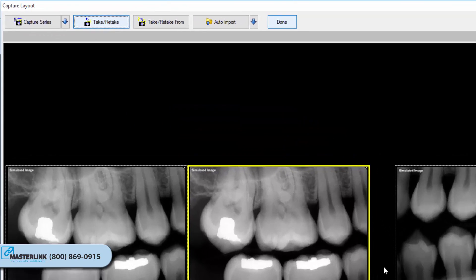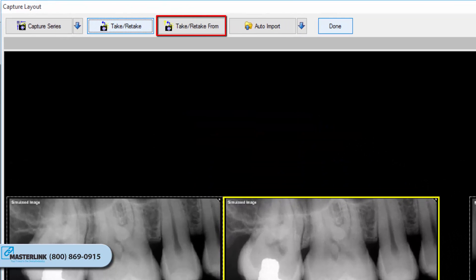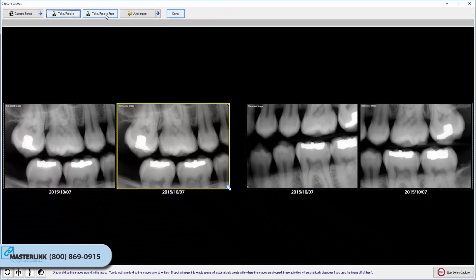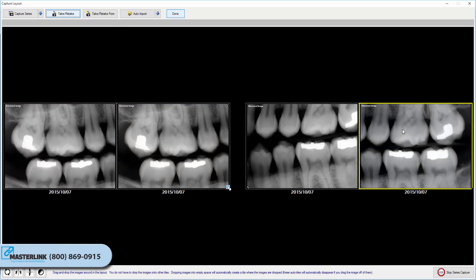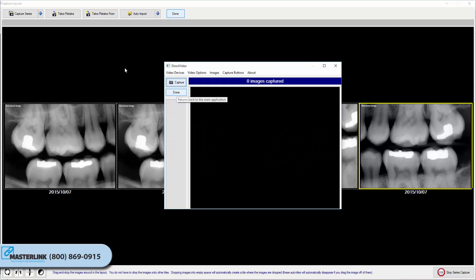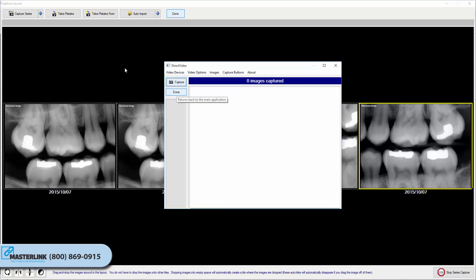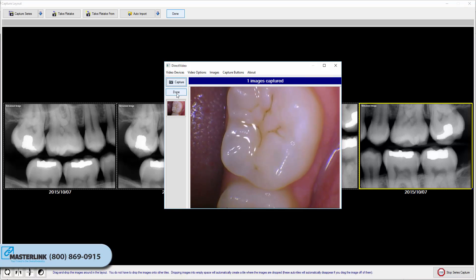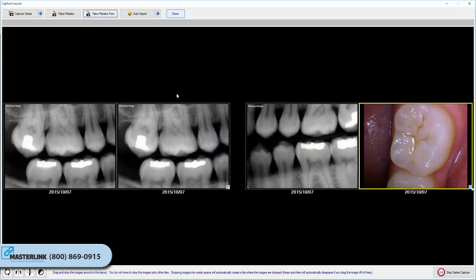The Take Retake From button functions the same way as the Take Retake button with one major difference: it allows the user to define a capture source that differs from the one currently on the tile. For example, if a layout is expecting to capture from a sensor but the user would instead prefer to capture from an intraoral camera, the user can select a tile and choose Take Retake From Video Source to capture an image from an intraoral camera into the selected tile.